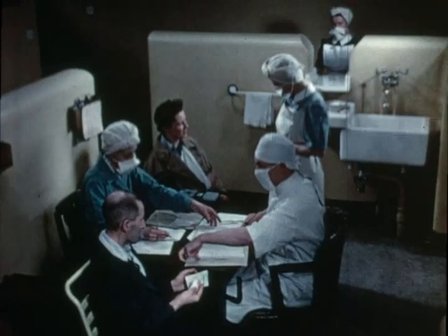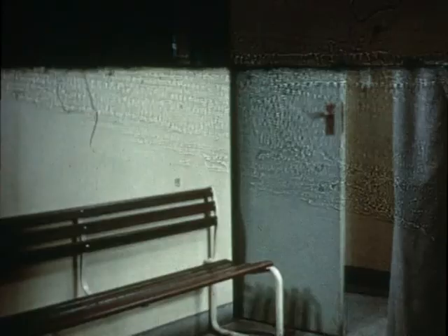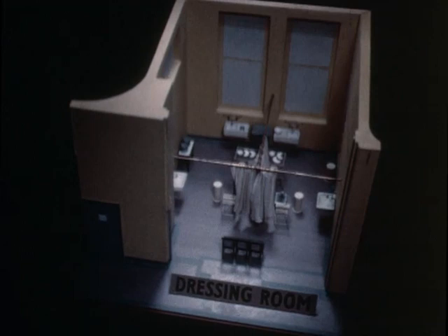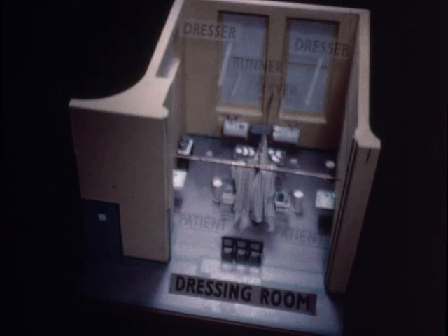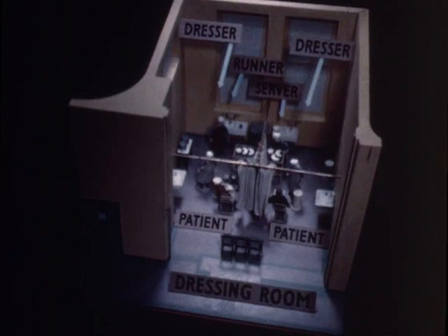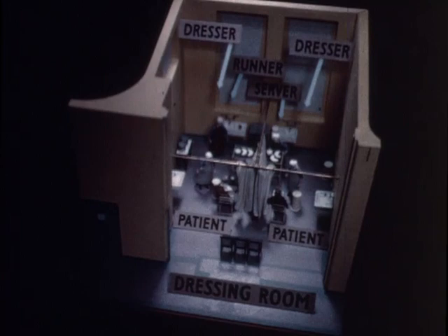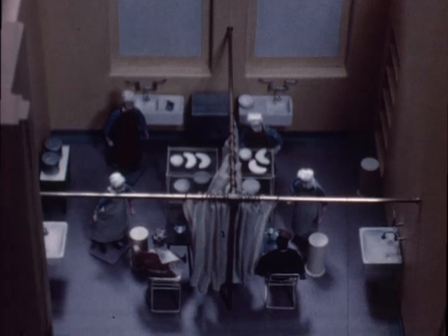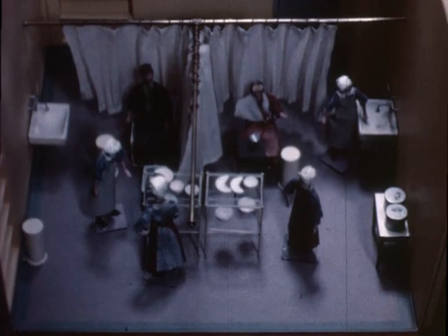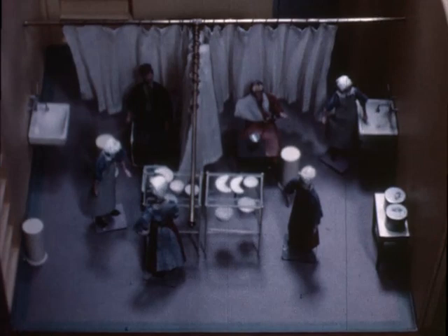The doctor writes the patient's treatment on a slip of paper and gives it to the patient to take to the dressing room down the corridor. Notice the arrangement of the dressing room as shown in this model. There is space for two patients to be dressed at a time. The staff of each dressing room comprises two dressers, one for each patient, a server who provides the material for both dressers, and a runner who is responsible for removing the patient's temporary dressings and for sterilising instruments and bowls. Near the centre of the room is the server's stock table, immediately behind which is the steriliser with a sink on either side. On each side wall is a wash basin for the dressers. There is a curtain separating the two patients' chairs, and on each side there is a deep bin for soiled dressings and a limb rest with a top that can be taken off for sterilising.